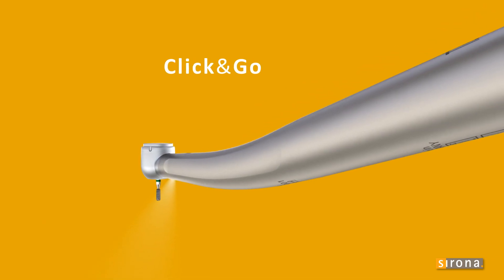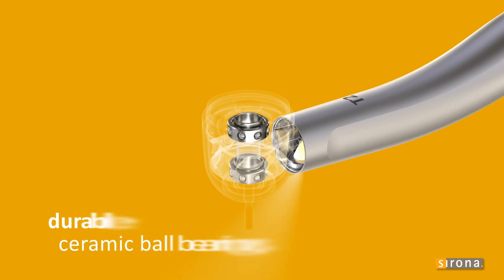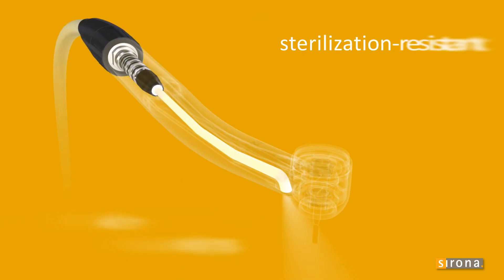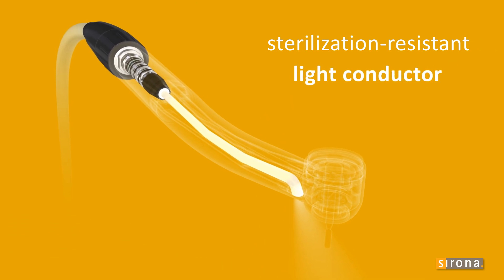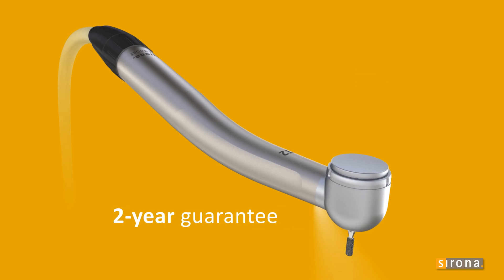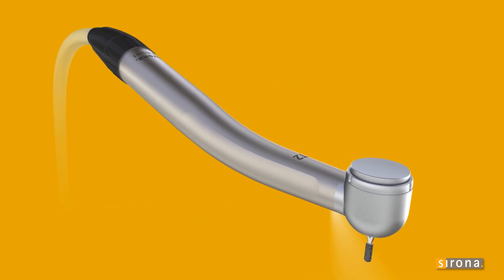Sirona turbines are provided for all standard types of coupling. The durable ceramic ball bearings, as well as an extremely sterilization-resistant fiberglass rod, combined with a two-year guarantee, make Sirona T2 turbines a great investment you can count on.